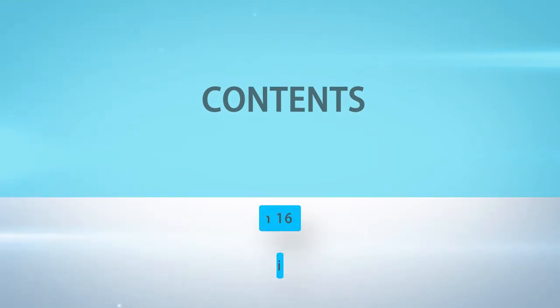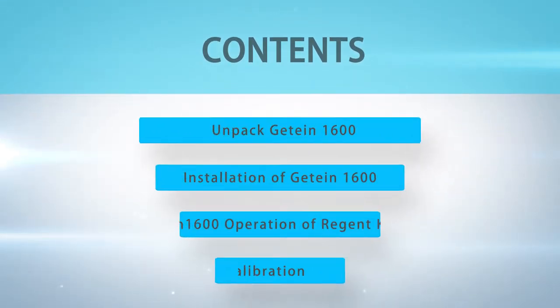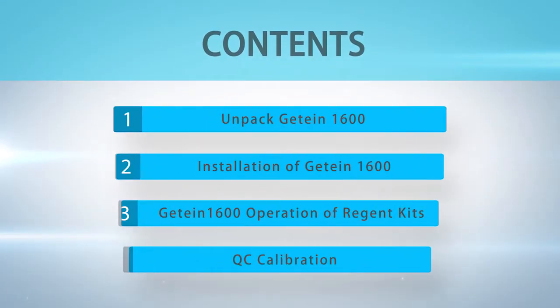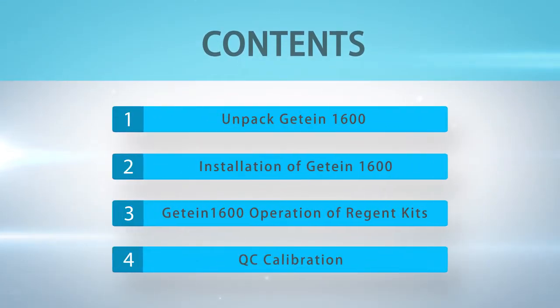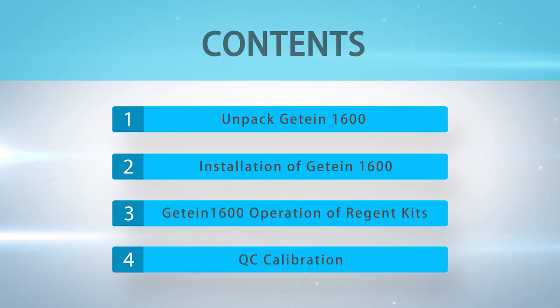Contents: Part 1, Unpack Getein 1600. Part 2, Installation of Getein 1600. Part 3, Getein 1600 Operation of Reagent Kits. Part 4, QC Calibration.